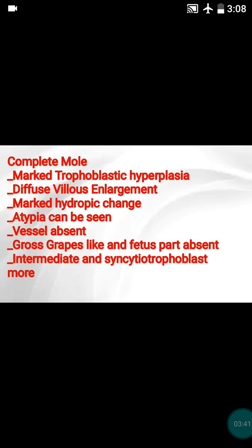In the villi, you will not be able to see nucleated RBCs or any vessels — that is a very important feature. Almost all villi are hydropically swollen, giving a gross appearance of grape-like clusters, similar to grapes. There will also be presence of more intermediate trophoblast, which is usually never seen in partial hydatidiform mole.